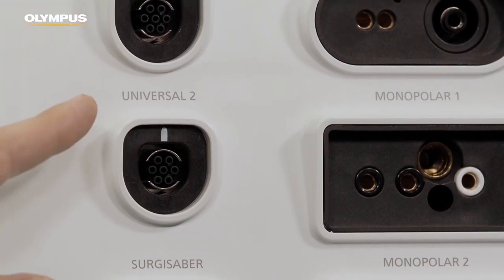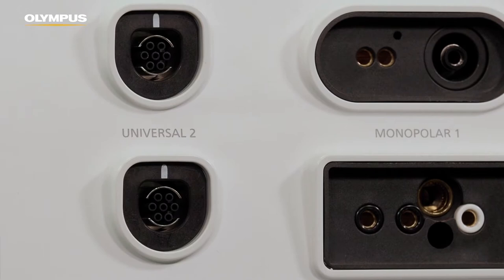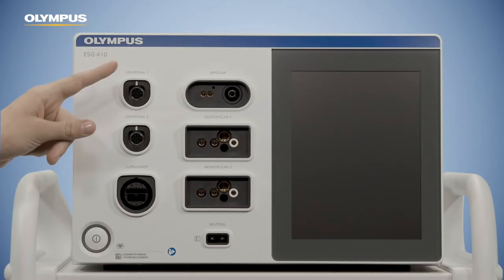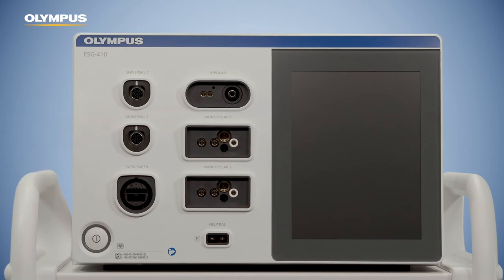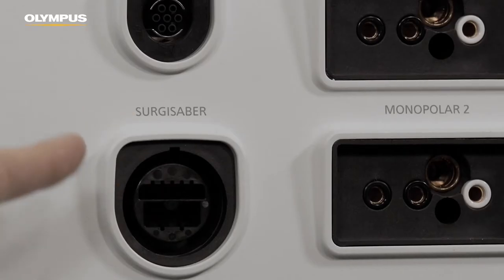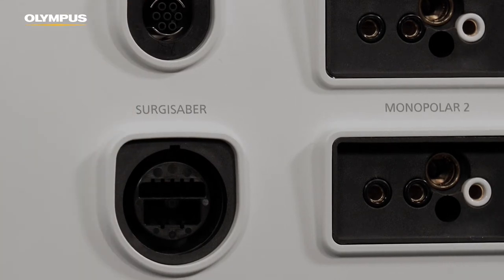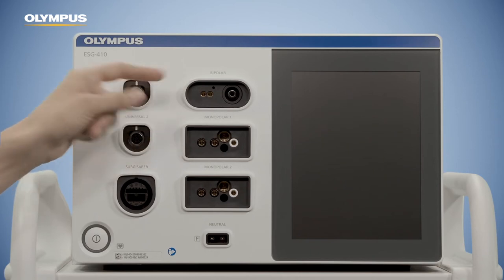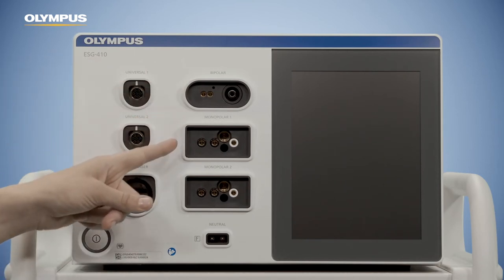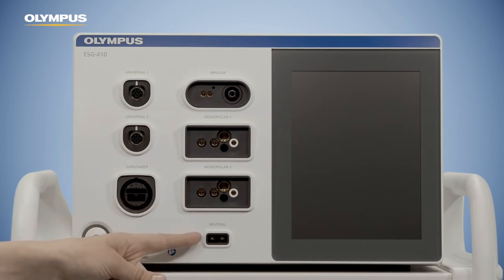You can connect two Olympus proprietary instruments using the Olympus Universal socket. The Universal socket is used for Olympus electrosurgical products and features instrument recognition. To the Sergisaber socket, no instrument can be connected for the time being. You can also connect one bipolar instrument, two monopolar instruments, and a neutral electrode.